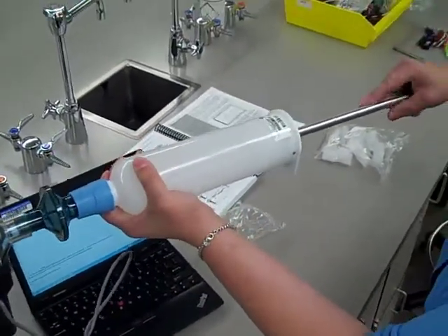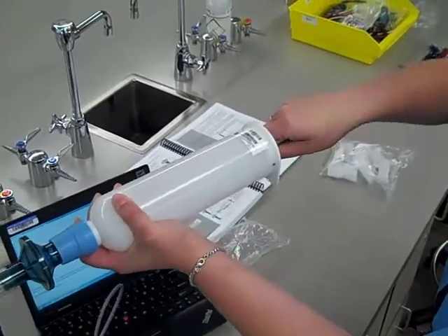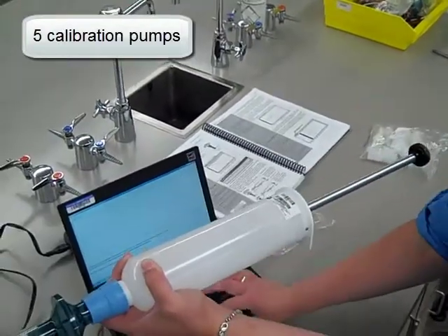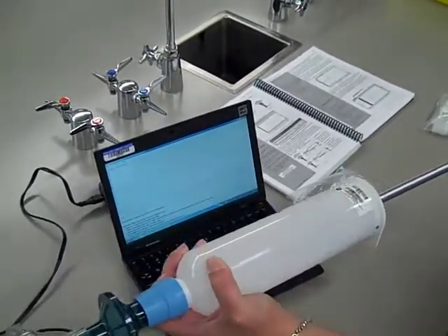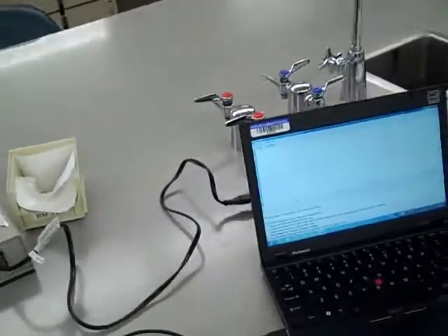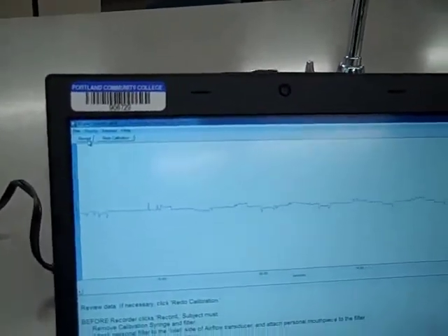And then you're going to simulate 5 breath cycles. In, wait 1 second, and then slowly pull it out. It should take about a second to pull out. Once you've done that, you'll click End Calibration on the screen, and you should be ready to go. Take a look at your data on the screen and compare it with the picture in your lab manual. It should look similar. If it does, then you're ready to go.